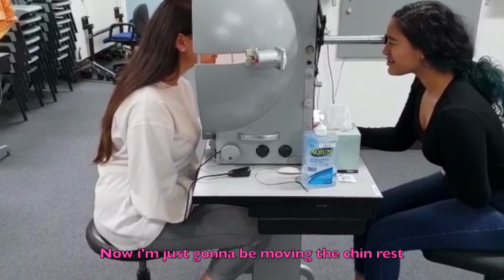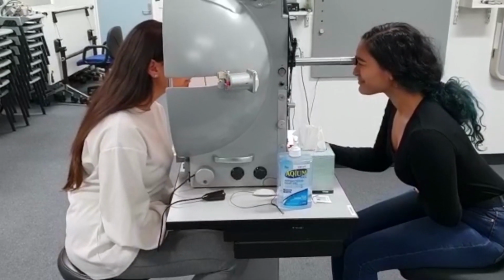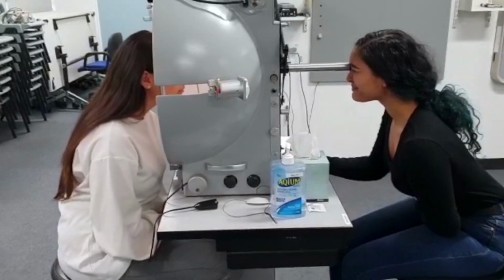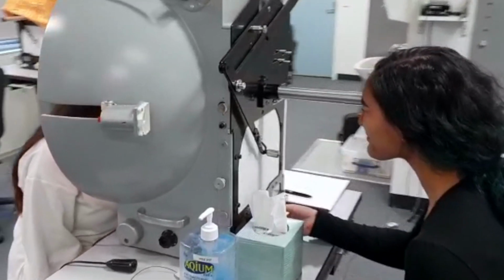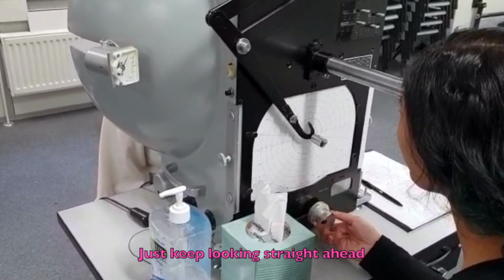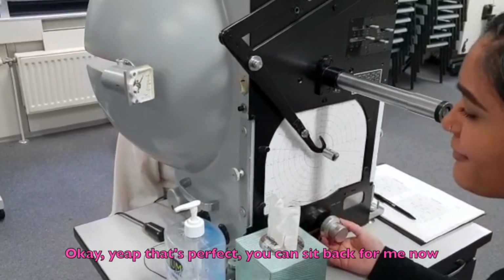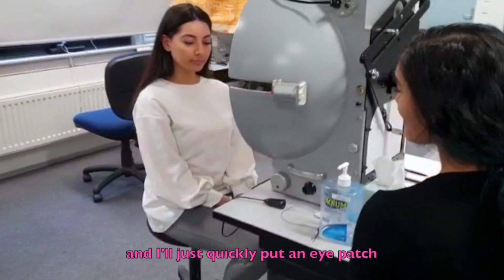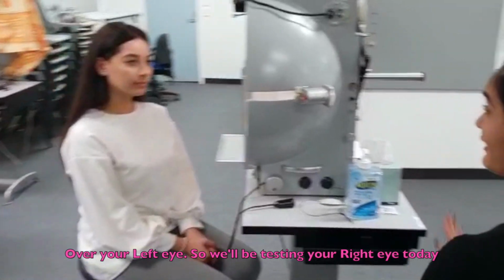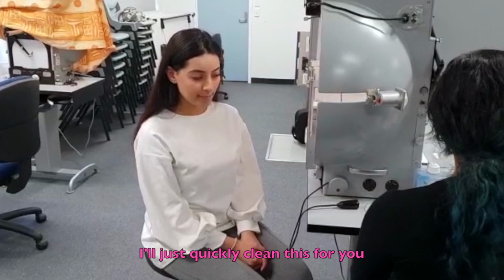And I'm just going to be moving this chin rest to the side and up and down. And keep looking straight ahead. Okay, yep, that's perfect. You can sit back for me now. And I'll just quickly put an eye patch over your left eye. So we'll be testing your right eye today. So I'll quickly clean this for you.